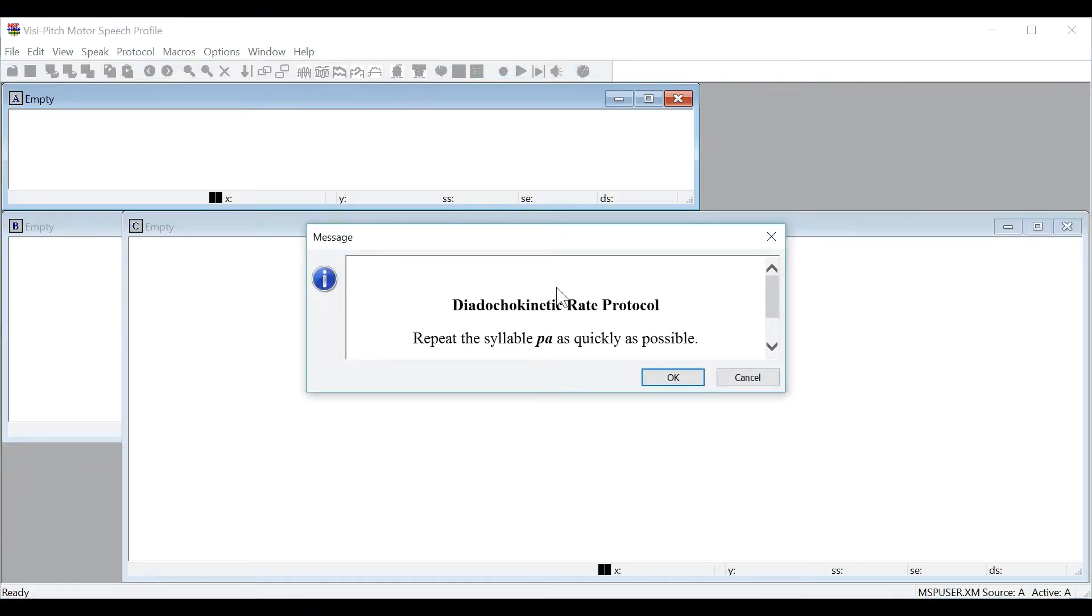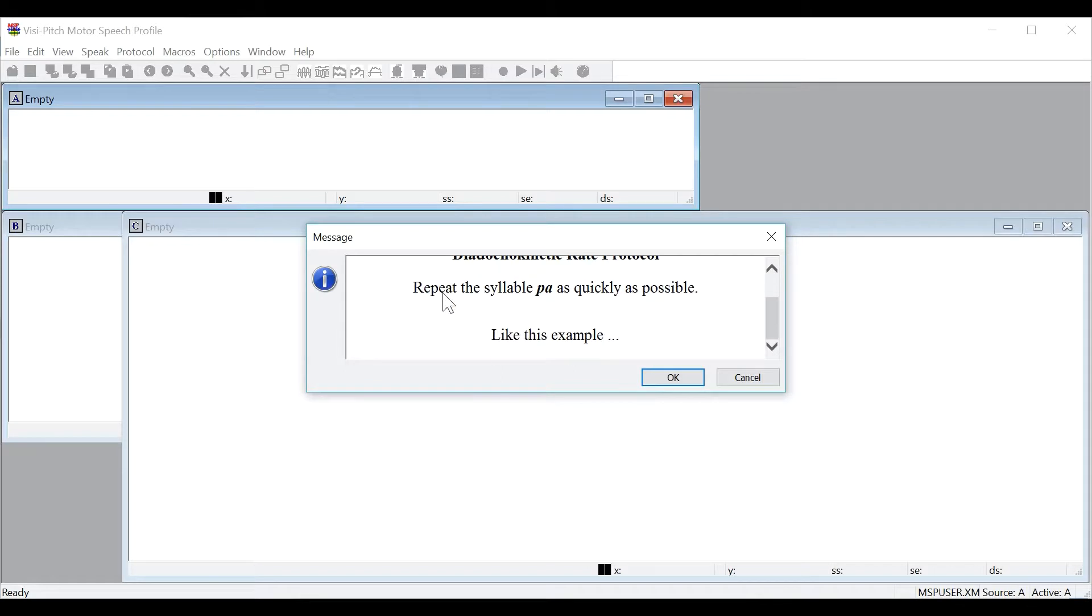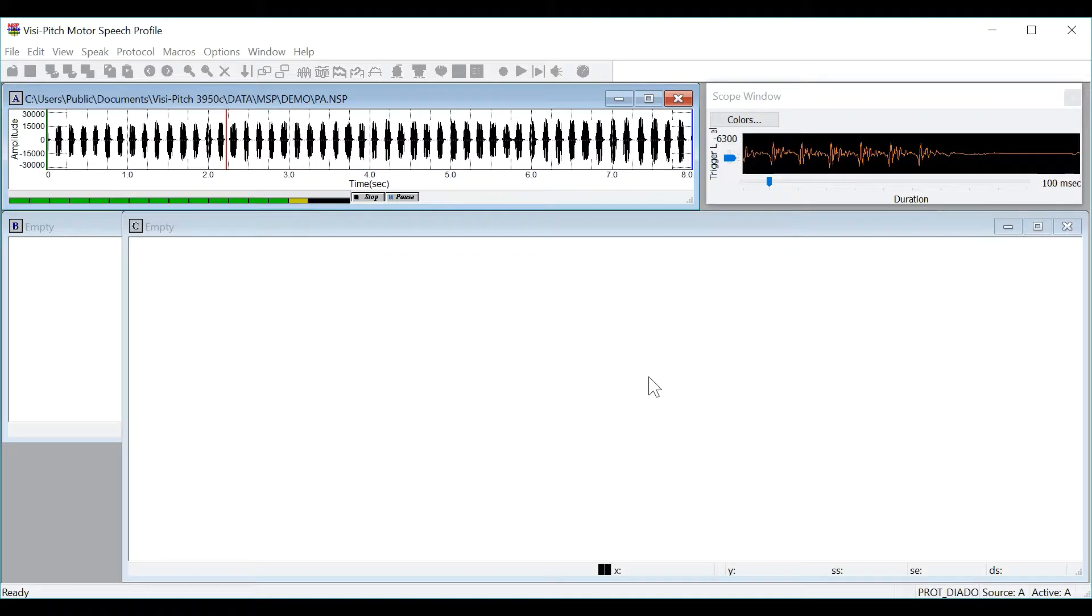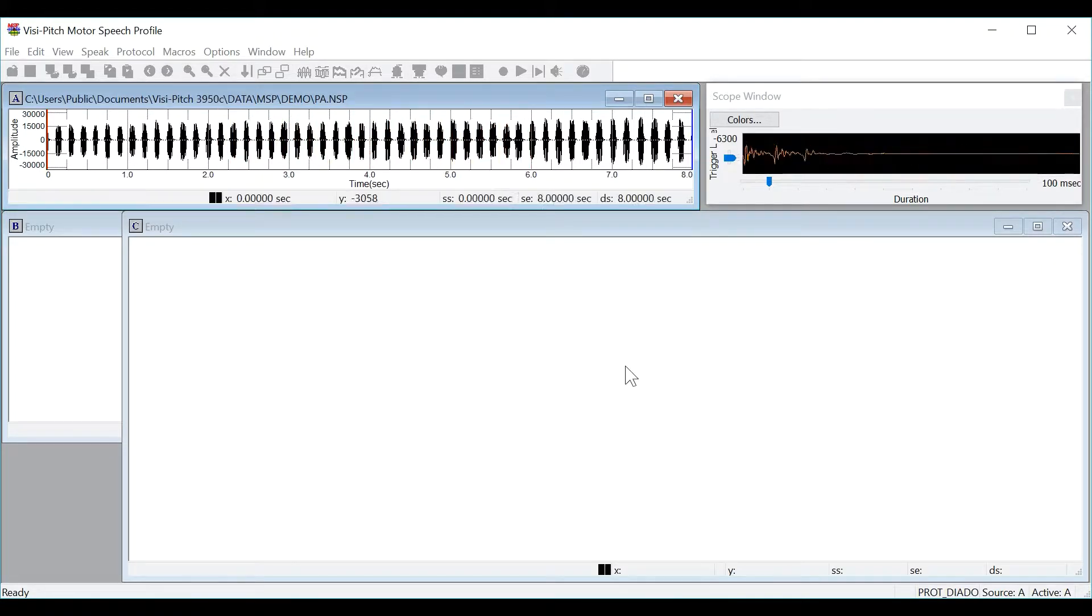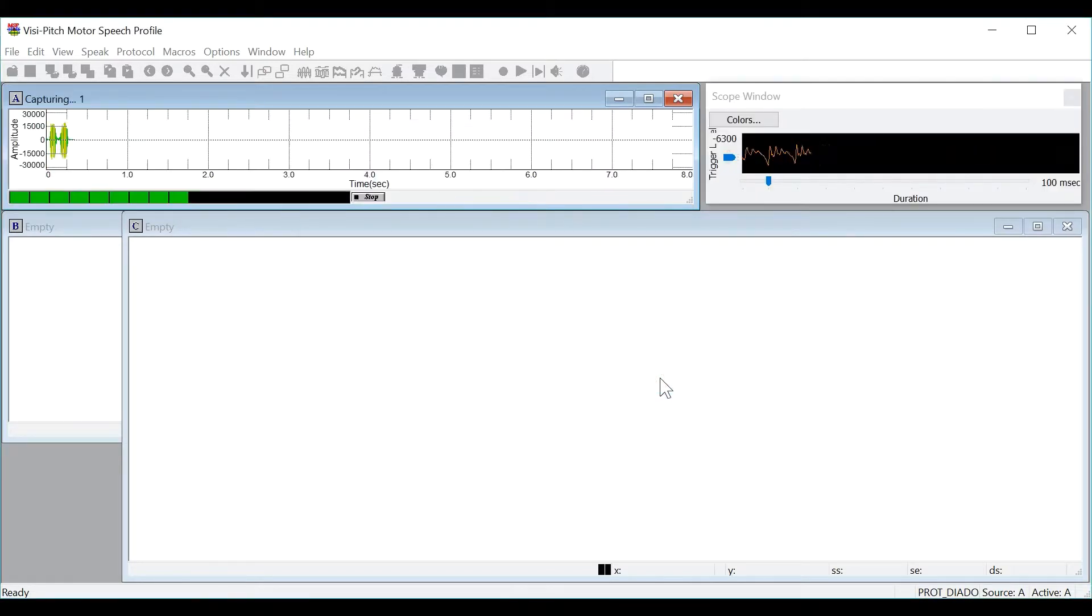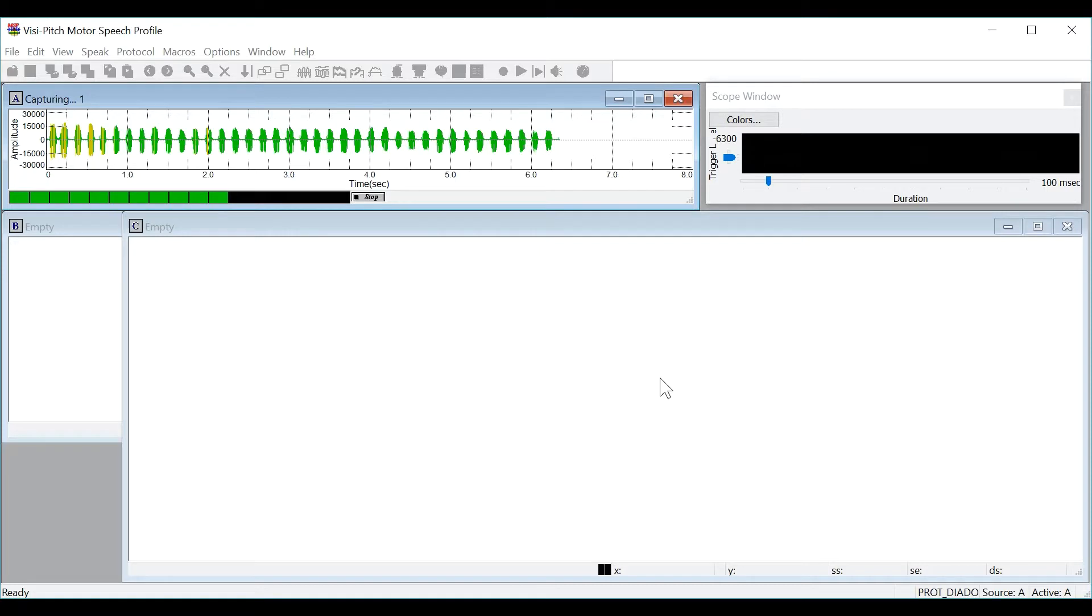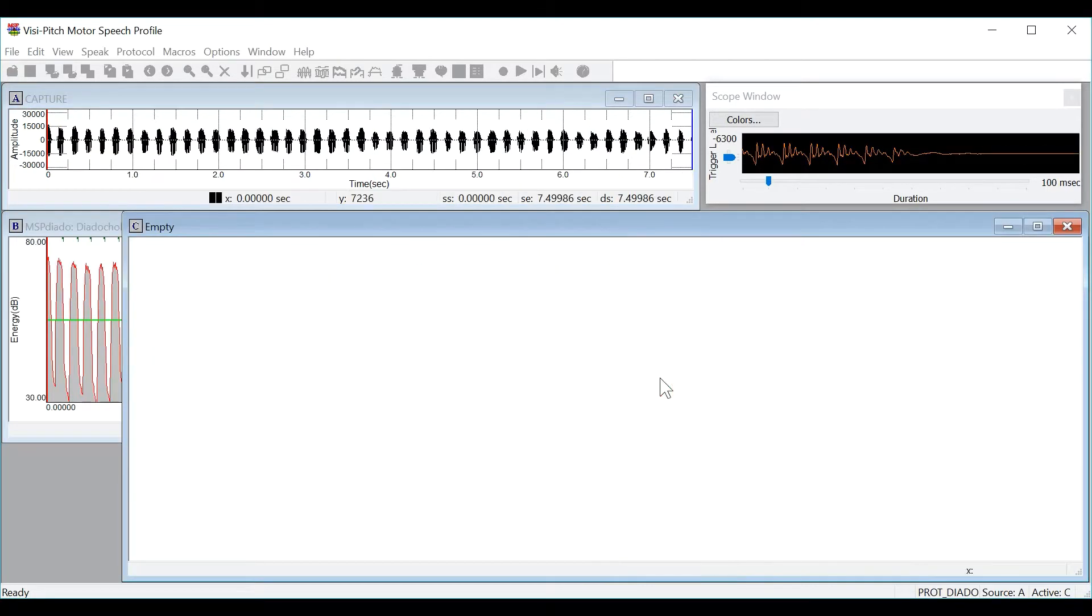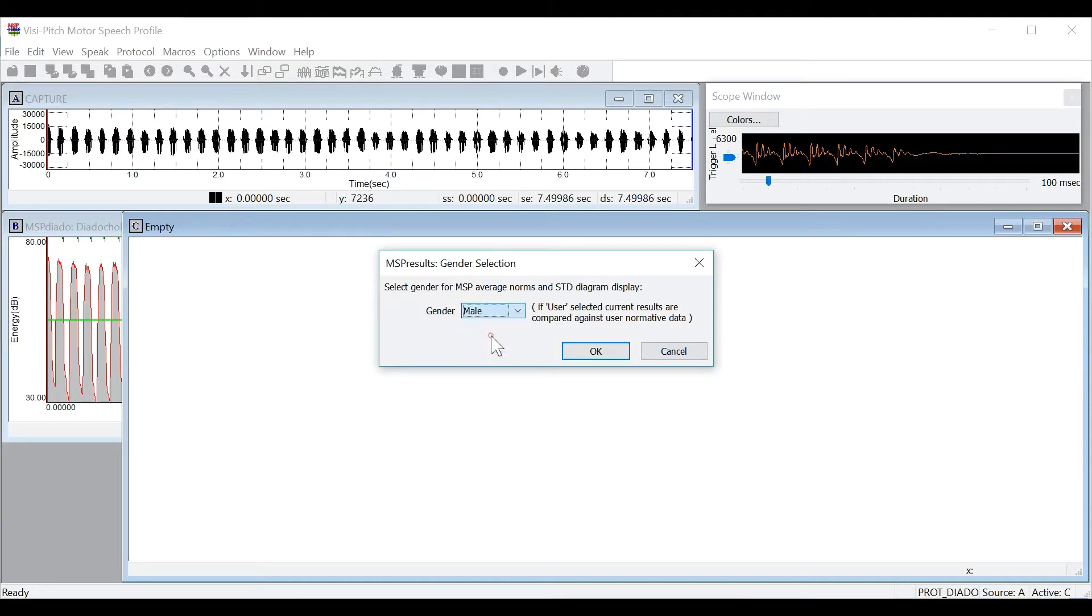You will see the program will tell you the prompt for the protocol and then show you an example of the protocol. I will then record my own sample and we will press ok to begin recording. You will then select your gender and press ok.